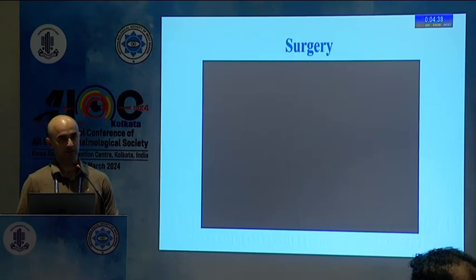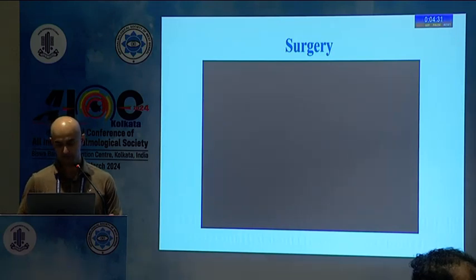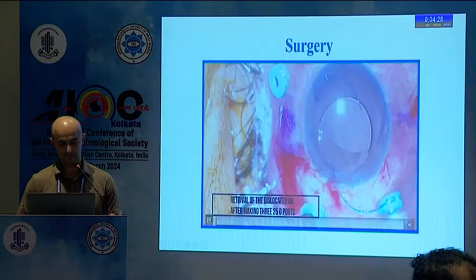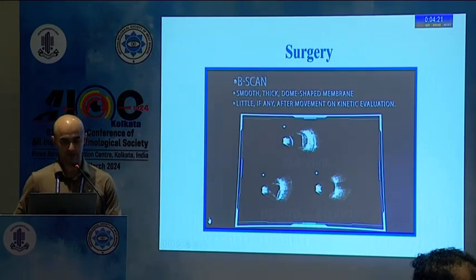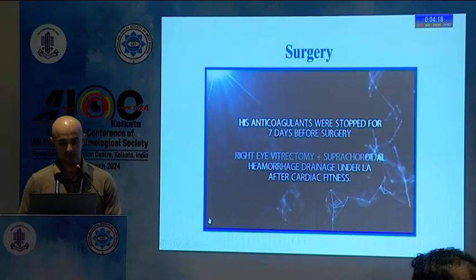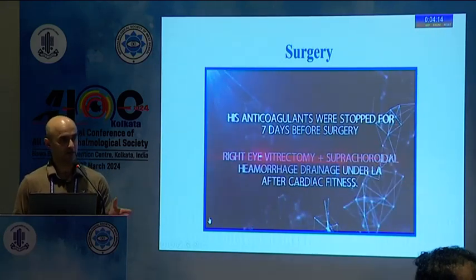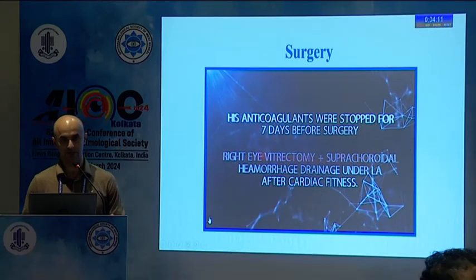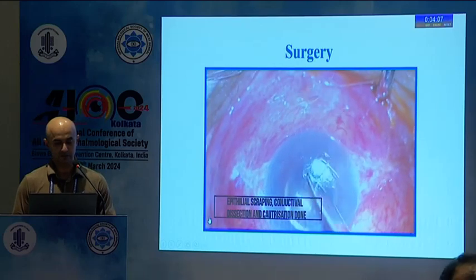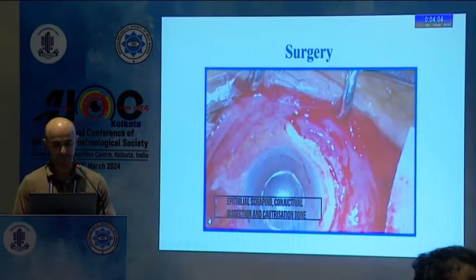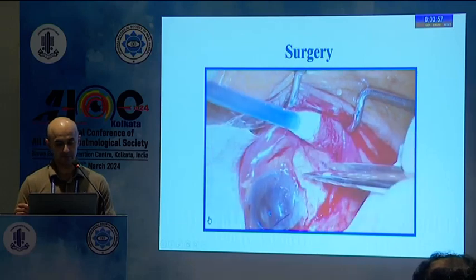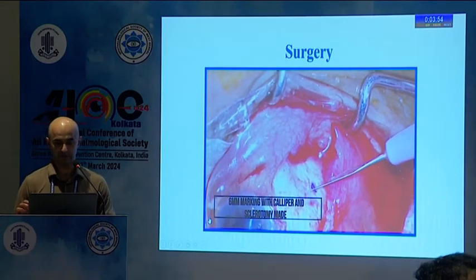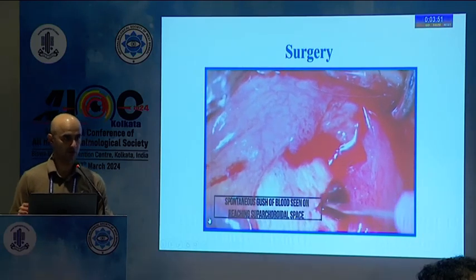But sometimes we are not so lucky. Here is a one-eyed patient who came with intraoperative supra-choroidal hemorrhage and subsequently had to undergo a second surgery for drainage of the supra-choroidal hemorrhage. This was a high-risk patient — one-eyed, on anticoagulants and anti-hypertensives, with cardiac and fitness-related issues. The cornea is already edematous because the pressure is very high. Since the timing between the first and second surgeries could not be precisely planned, we proceeded with conventional drainage of the supra-choroidal hemorrhage, anticipating some clots.